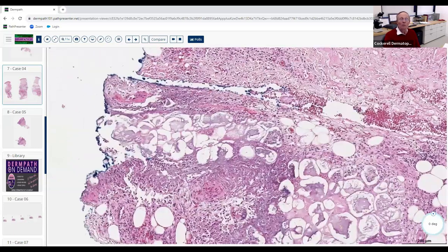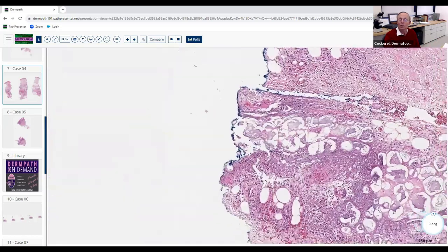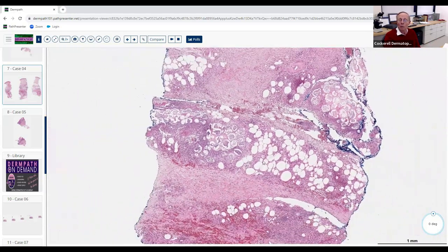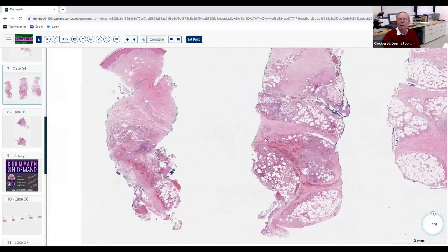Circulating lipase causes fat degeneration — it causes saponification, forming calcium stearates. This is soap in your skin. If you injected soap into your skin, you'd get lots of neutrophils, lots of inflammation — and that's what we see here. This is not truly a primary inflammatory paniculitis; it's a secondary paniculitis caused by lipase causing fat degeneration and calcium stearate formation, essentially a foreign body reaction. This is saponification — the ghost cells are calcium reacting with long-chain fatty acids released by the lipases. Pathognomonic picture. When you see this, you must find the pancreatitis.